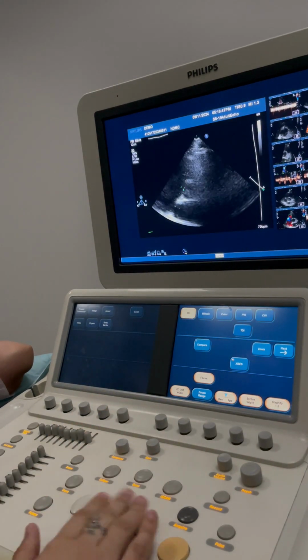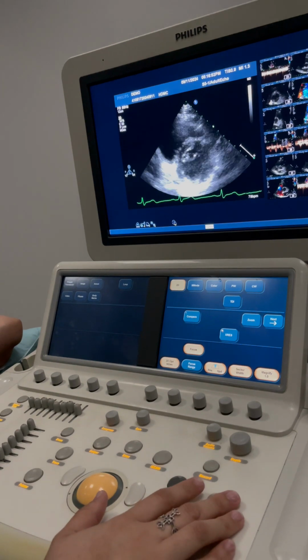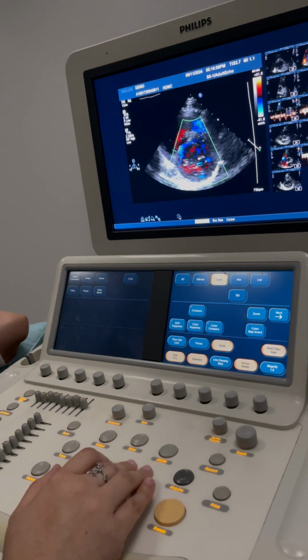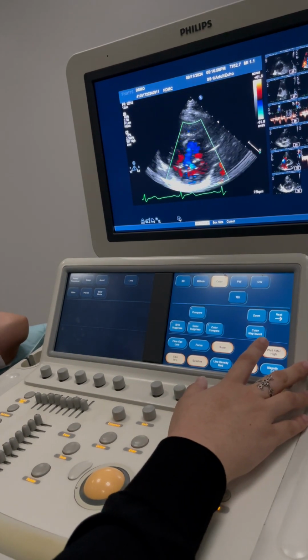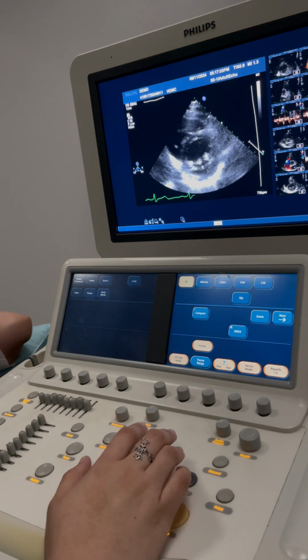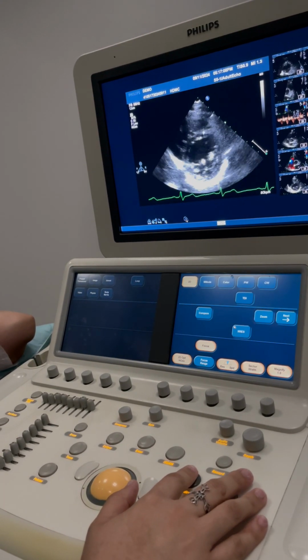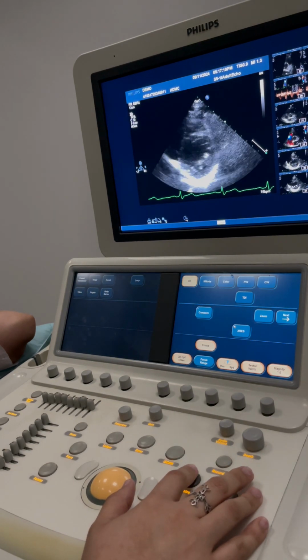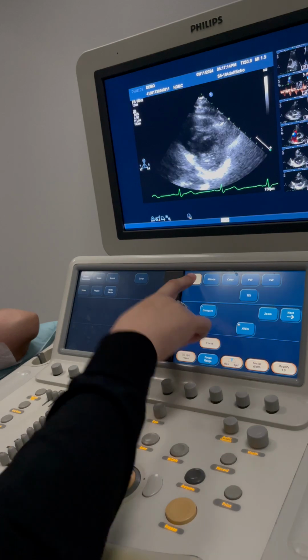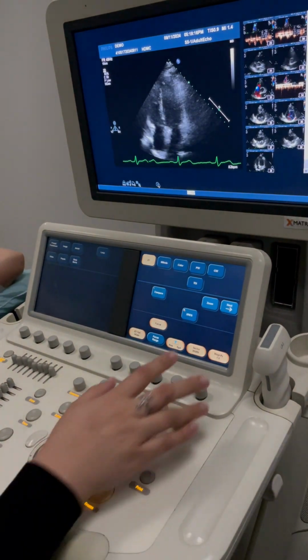Okay, now you're just going to go to the mitral level. Store that in 2D. Add your color. Apply that. Take your color off. Then go to papillary and apex. Okay. You're going to store that, the full 4-chamber view.